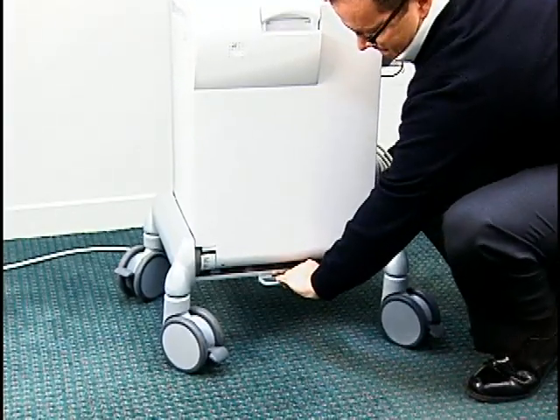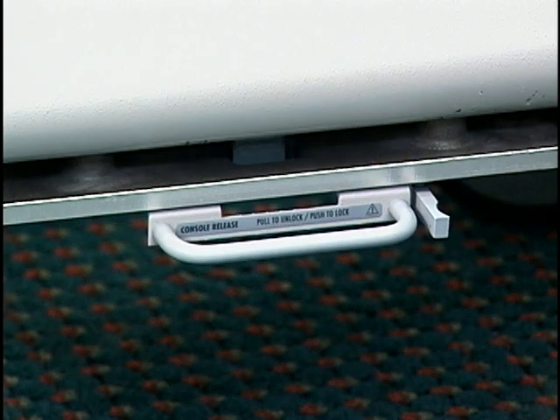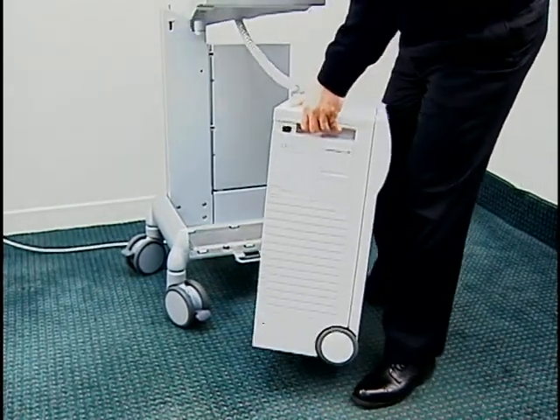To remove the console with the battery pack attached, unlock the console by pressing the tab here on the right of the console release handle and pull the handle straight out like this. Lift the pump console straight up and off the cart.